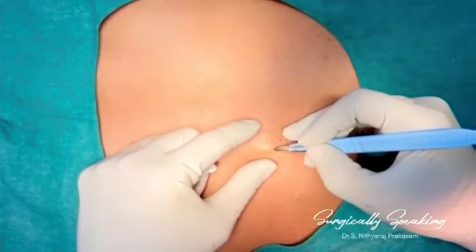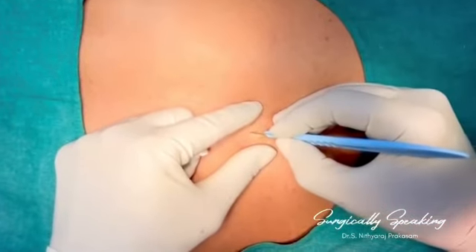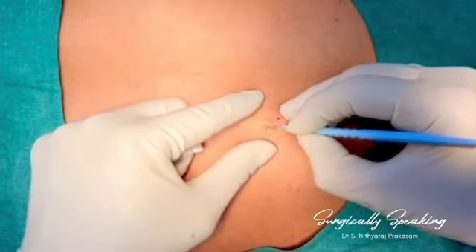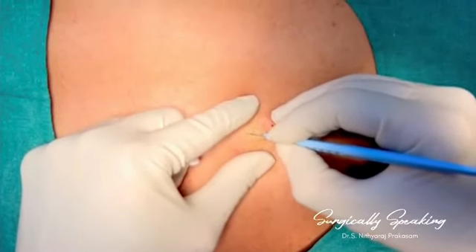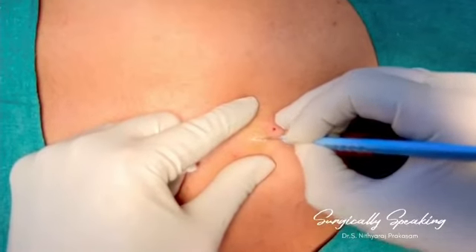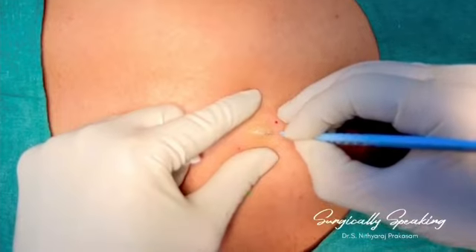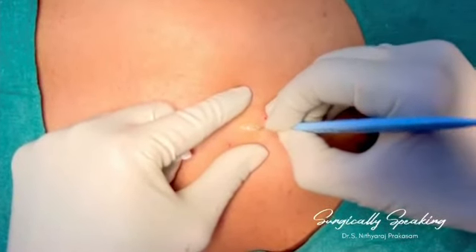Now this is the 15 blade I'm using, and I'm making a very slender ellipse around the punctum. Along the line of incision, my infiltration is making it easy for me to make that incision.